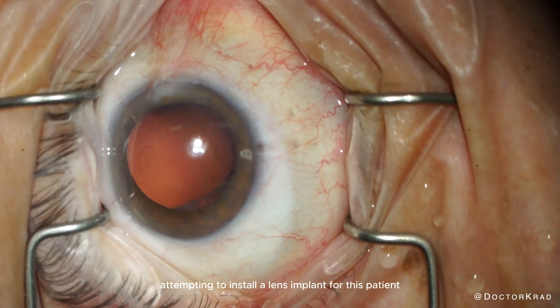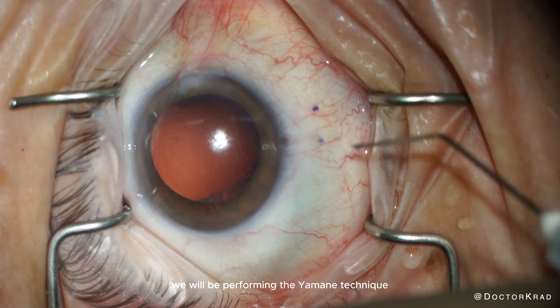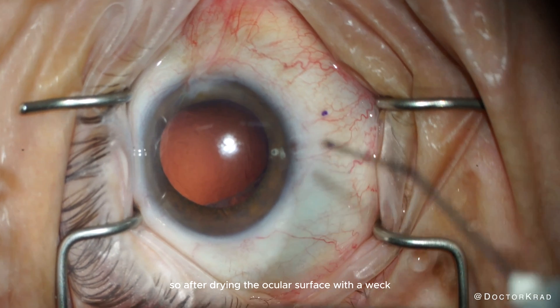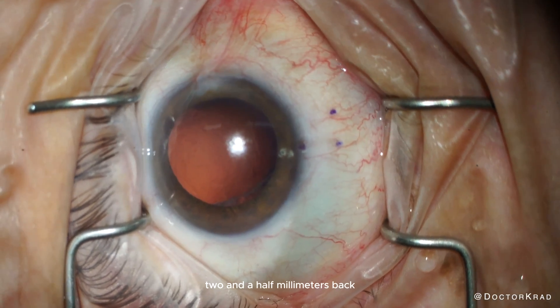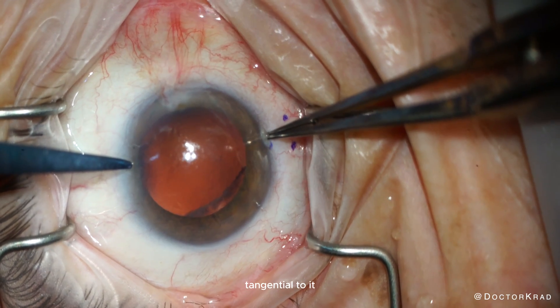So here we are attempting to install a lens implant for this patient. We will be performing the Yamane technique with the Kim modification. After drying the ocular surface with a Weck-cel sponge, we're marking the limbus two and a half millimeters back, and then two millimeters tangential to it.